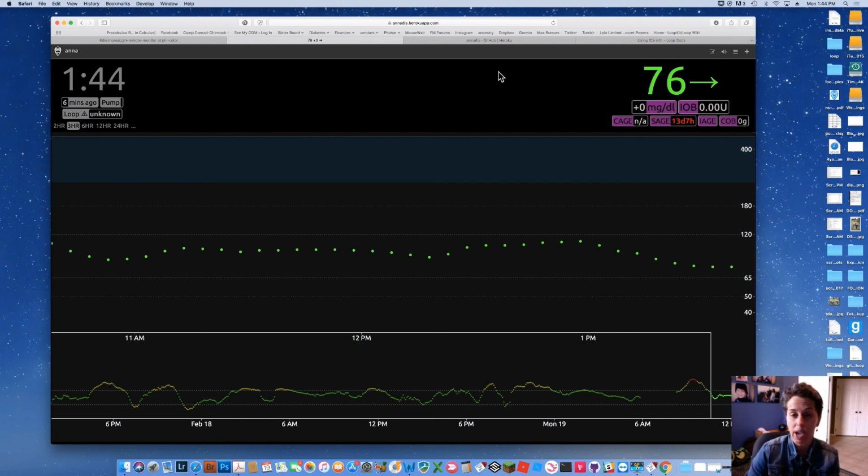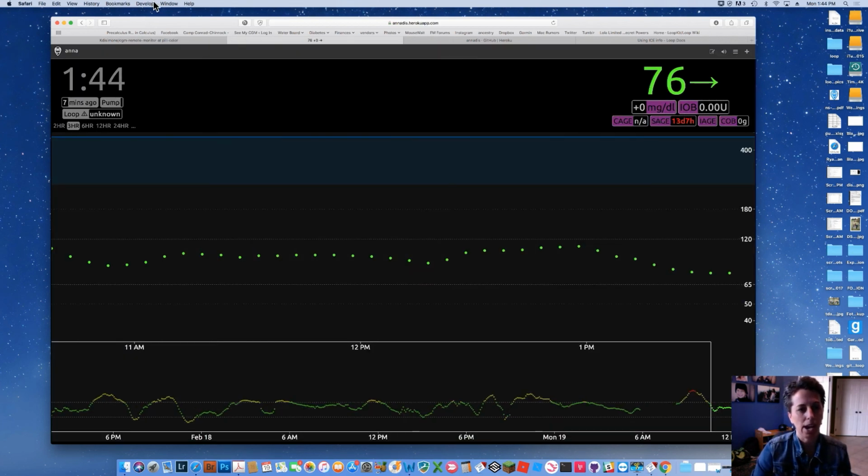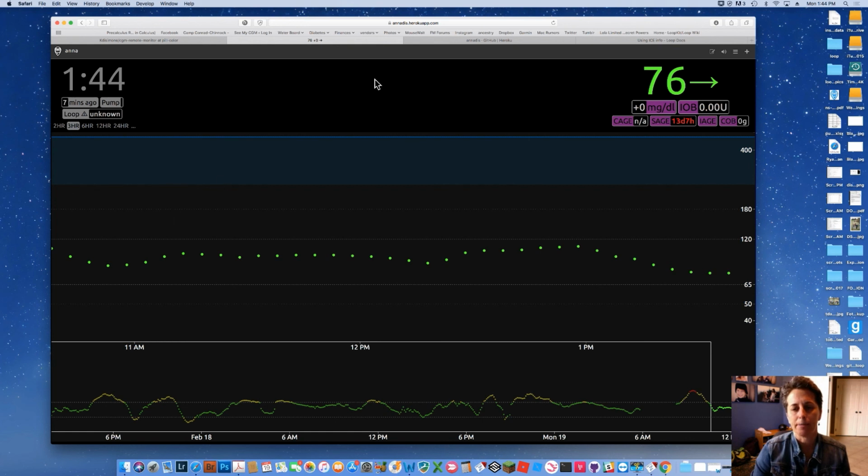But I just thought I'd show you how it works if you want to create a new branch, sort of customize things. That's how creating new branches and putting in your code works: you can do things at your home library and your home cookbook that don't affect anything at the library and only affect you, and customizing your Nightscout site. You can play around with that page source. It's super easy and fun to play around with that and change colors and sites and all of that kind of stuff. If you want to get a little bit more personalized, it's super fun. It might make them pop. So anyway, that's one example, customizing your Nightscout site display using the CSS.